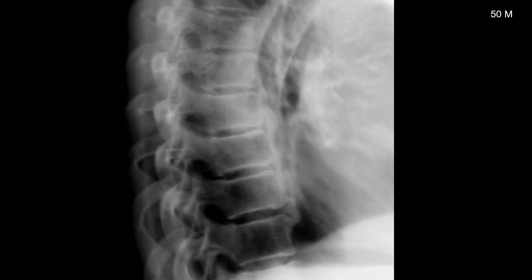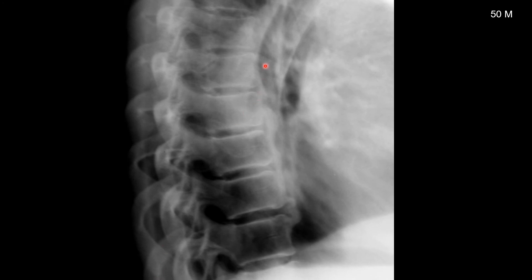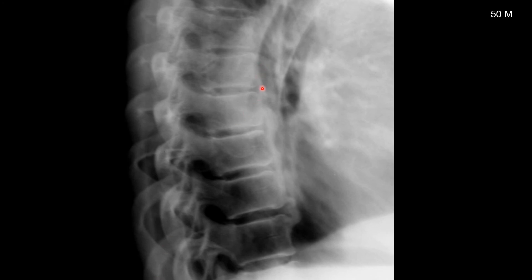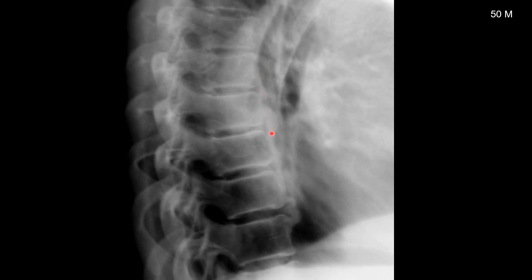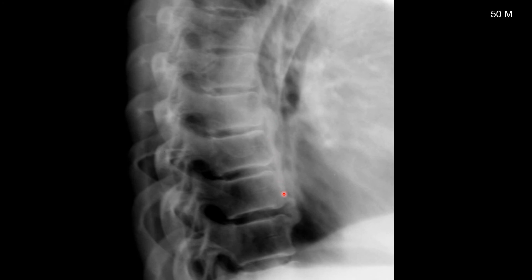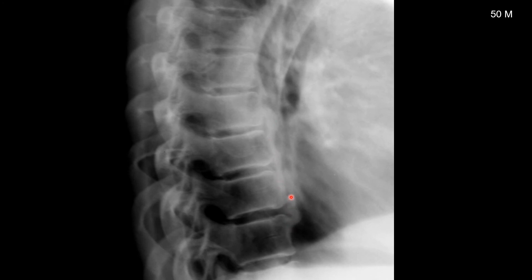This is a 50-year-old male with flowing hyperostosis anterior to these thoracic segments. This is a classic presentation of DISH.